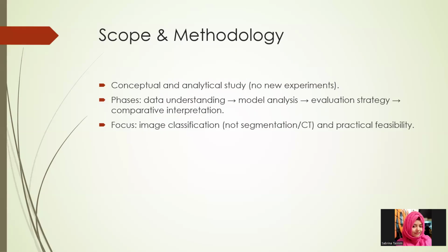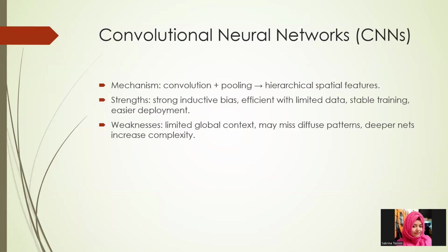The focus is strictly on image classification using chest X-ray. It doesn't include segmentation tasks or CT scan analysis. The goal is to evaluate methodological soundness and practical applicability. In slide 4, we are seeing the convolutional neural network.